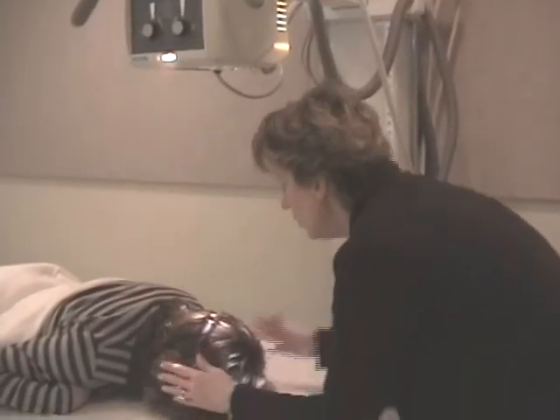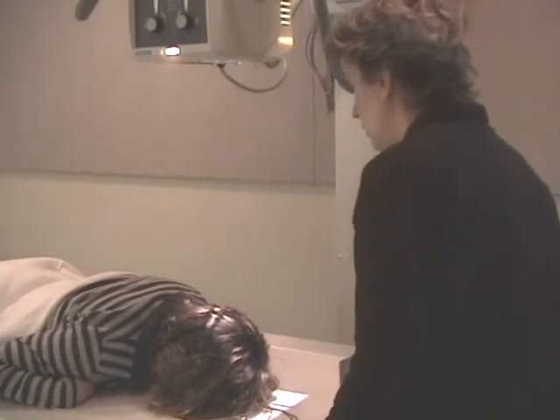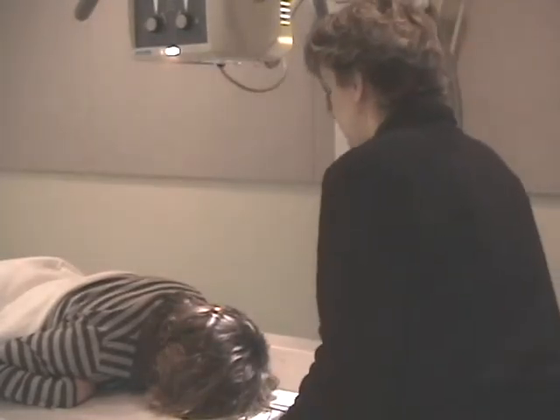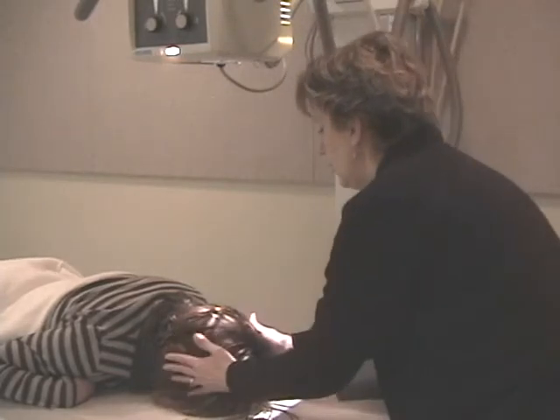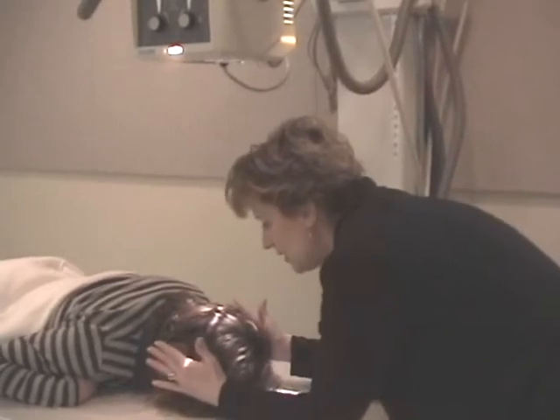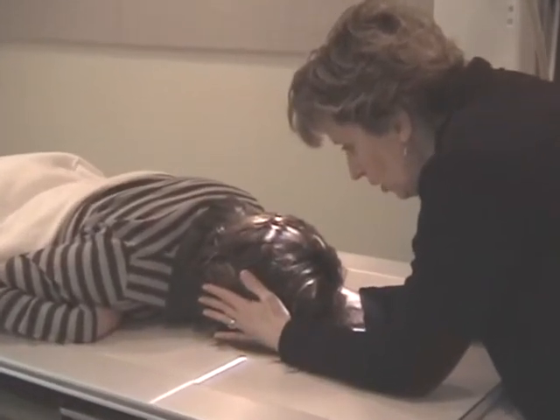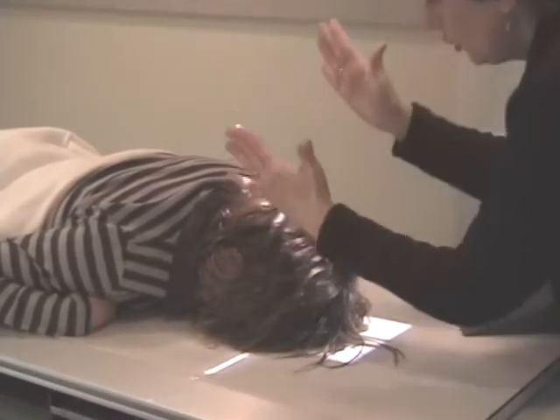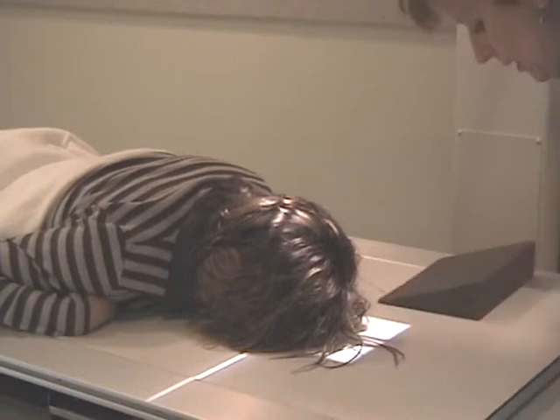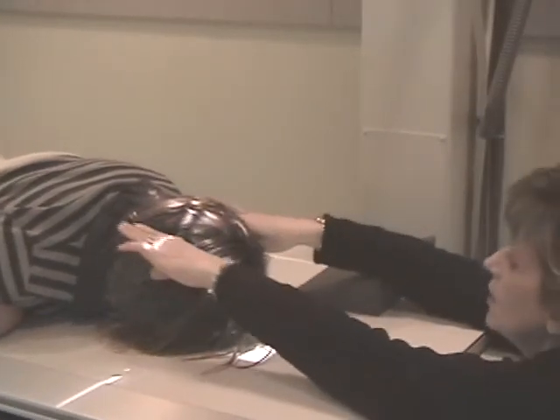and I'm getting her skull centered side to side, putting the MSP to the center. Okay. And now the trick is, techs will do multiple tricks. You can feel the sides of the skull and make sure that relationship is the same. You can actually get down, and the camera can focus in on this.